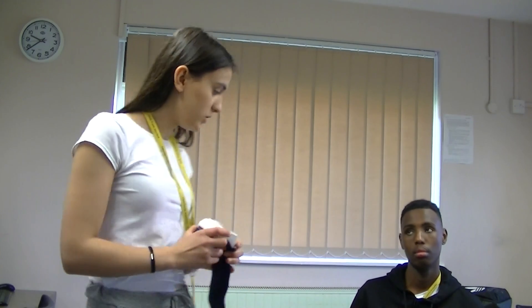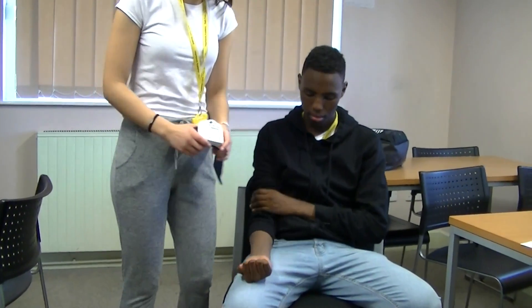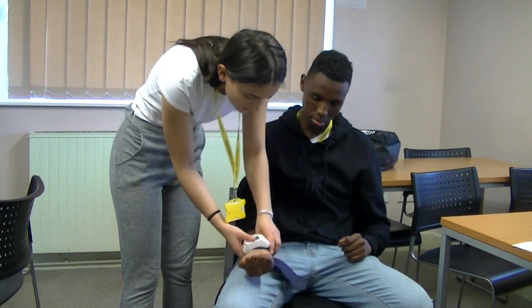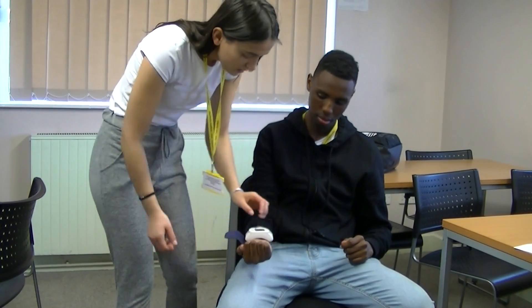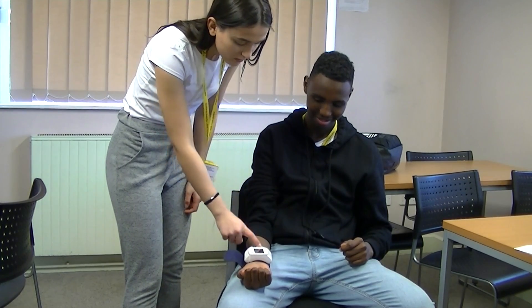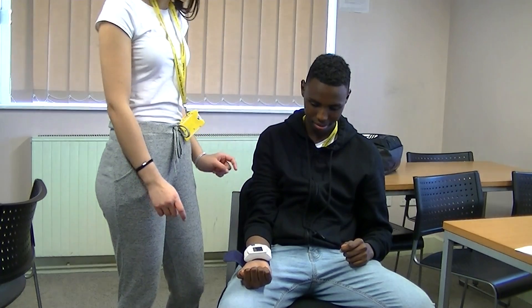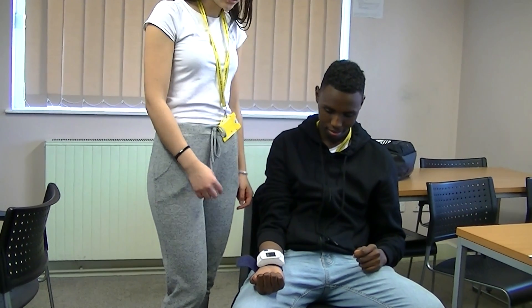I'm going to test the blood pressure using the blood pressure monitor on my client. I'm going to test it on the inside of his arm where it measures the pulse. He has his arm at a 90-degree angle so the blood is not flowing backwards — it's just normal.